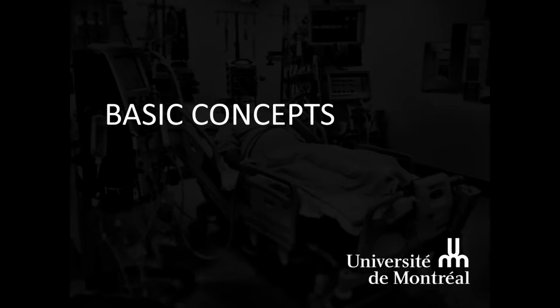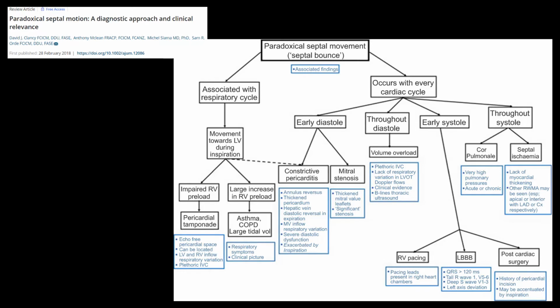We will quickly highlight some basic concepts related to the acquisition of proper interventricular septal assessment. I want to refer you to a very interesting article to understand all the septal shifts and an approach to differentiating them. It is definitely worth a read if you have the time, but it covers way more than we will go over in this lecture. We will cover the basics of the most important elements related to interventricular assessment. There are a myriad of other causes of more septal changes, which will be covered in a different video.